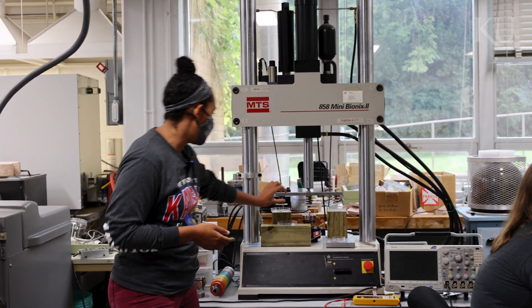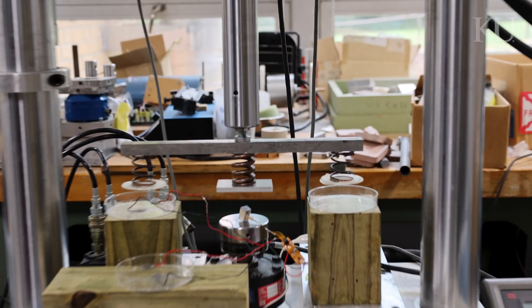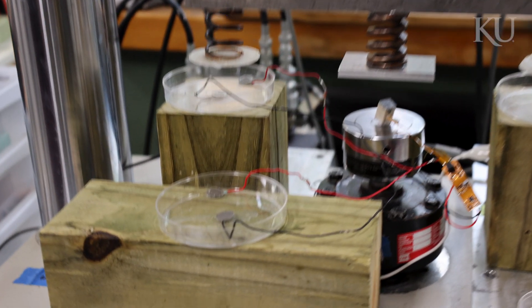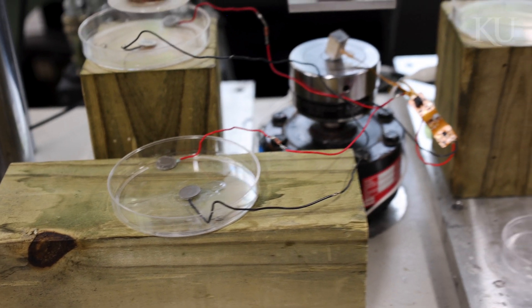Our implant is very tiny and we just load it right down here. We have a rectifying circuit that changes it from AC to DC, and then the signal goes to these electrodes where we will place bone samples, specifically from the spine of porcines.